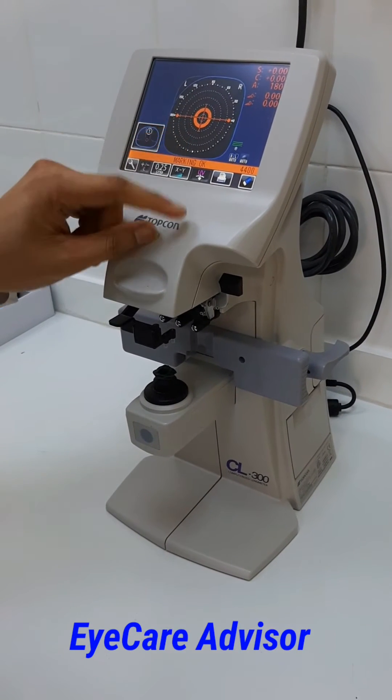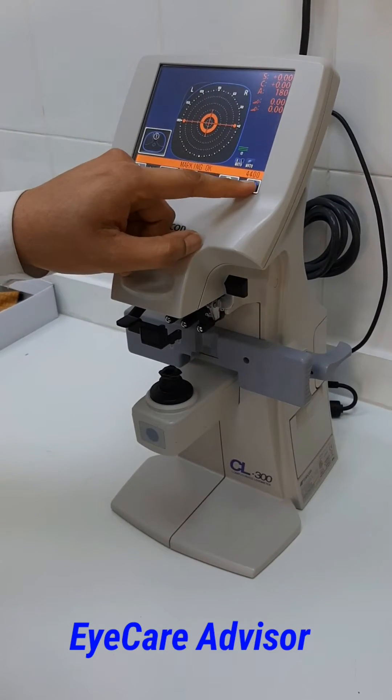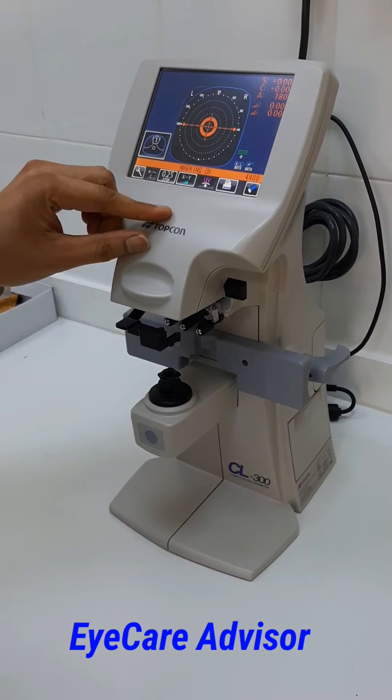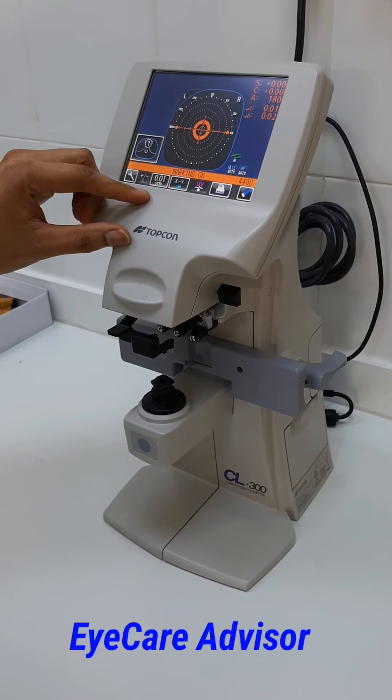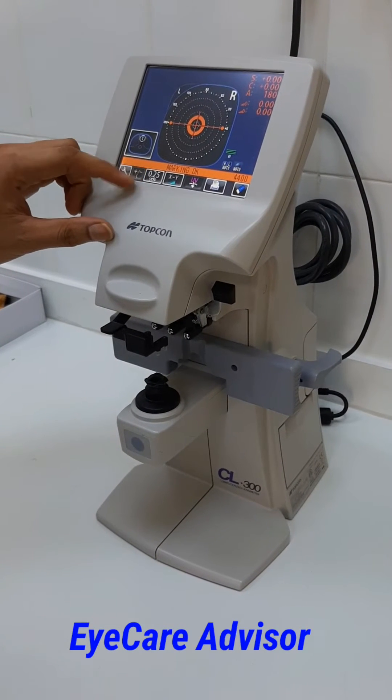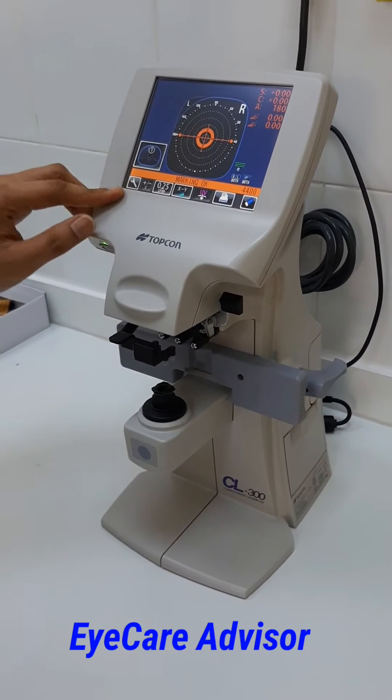This is for spherical single vision lenses. There are controls — for example, this is the eraser, this is the printer. These are the steps: if you want 0.25, 0.12, or 0.1, you can select them. This button is for plus and minus cylindrical prescription, and this is for the settings.